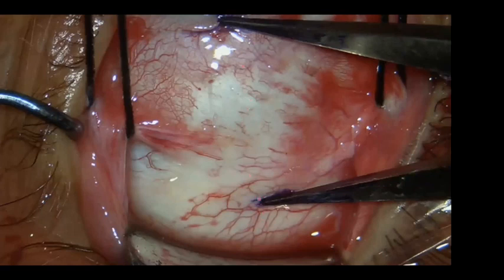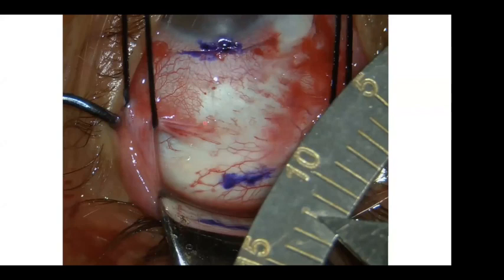It is centered between the lateral rectus and superior rectus here, and from this distance I go for 12 millimeters. What's written in the books, and what I used to do, is to put the implant 8 to 10 millimeters back so that the implant is usually visible. Nowadays I switched my technique to move the implant posterior, and I'm so happy with that step.